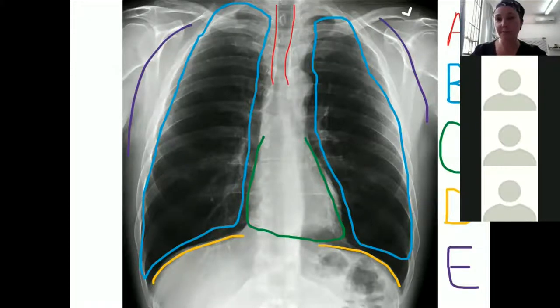Moving on from B, next thing you're looking at is C, that would be your circulation, and that's your cardiothoracic ratio. Does your heart look normal? Is your cardiothoracic ratio enlarged? Is it the normal size? Anything abnormal you can see with the heart? D for diaphragms. Do the diaphragms look nice and clear? Can you clearly see them on both sides? Is there any air underneath the diaphragm?